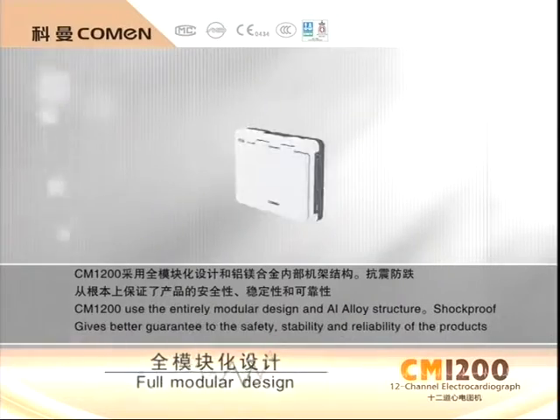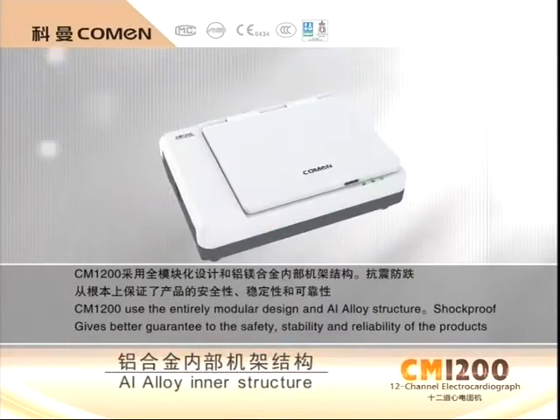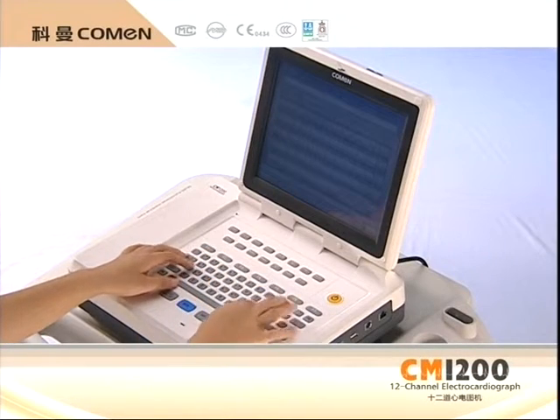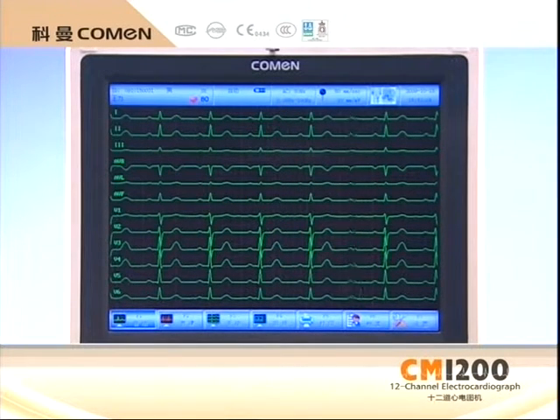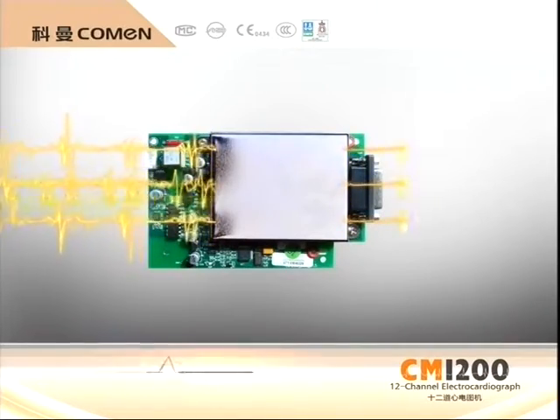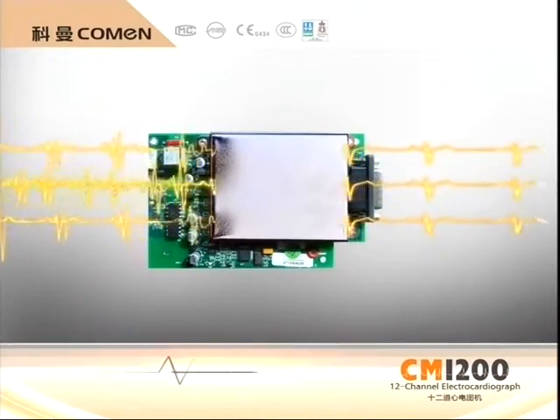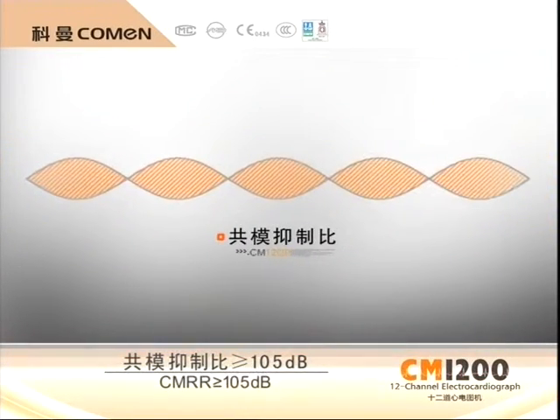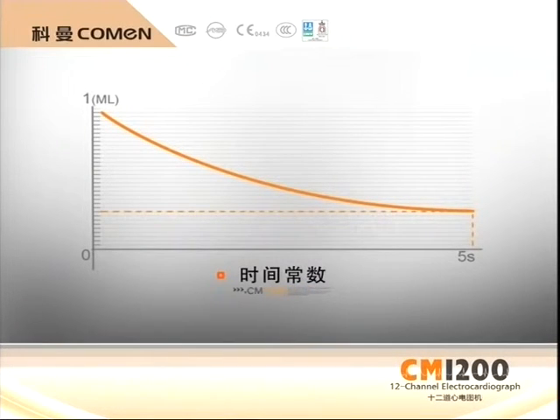The CM1200 adopts a modularization design and a die-cast magnesium alloy inner frame structure, featuring shock-proof and drop resistance that ensures the safety, stability, and reliability of the product. Because CM1200 applies digital filter design, it is resistant to baseline drift, enjoys powerful interference resistance, incorporates outstanding sensitivity, and provides a more stable and accurate ECG wave.